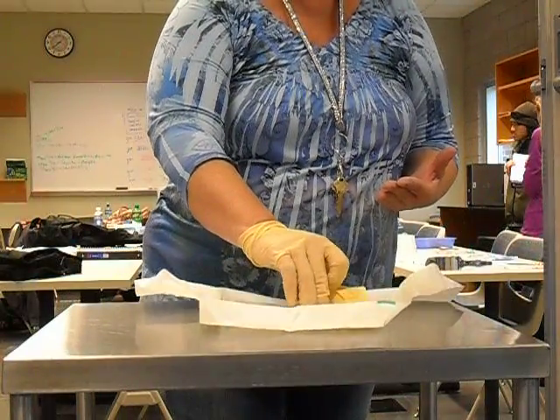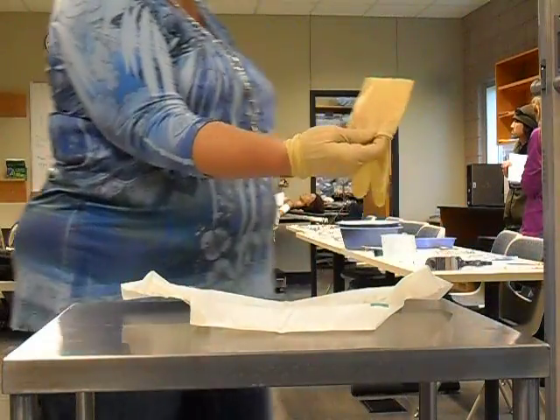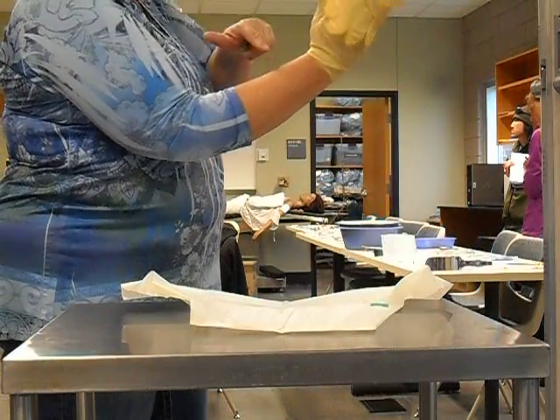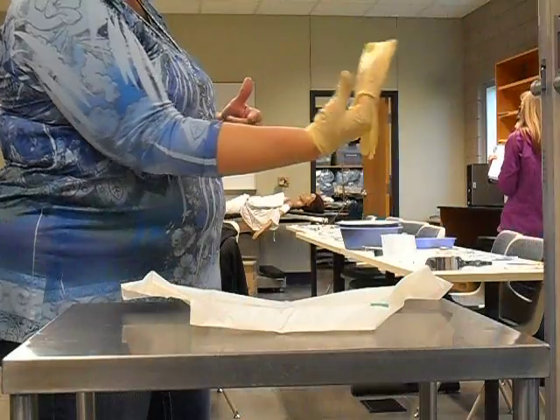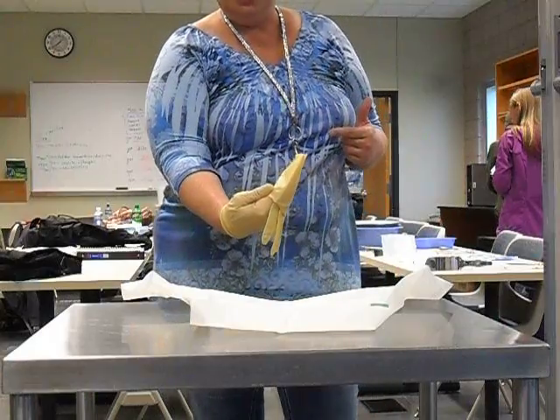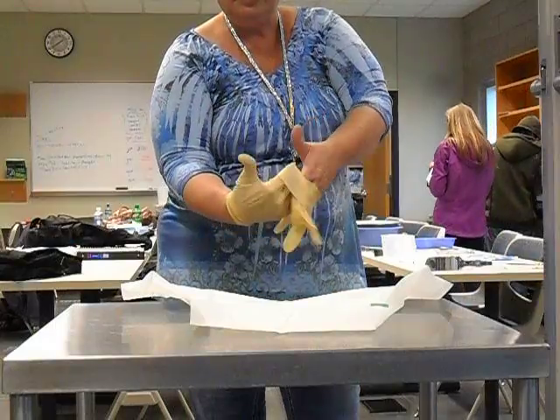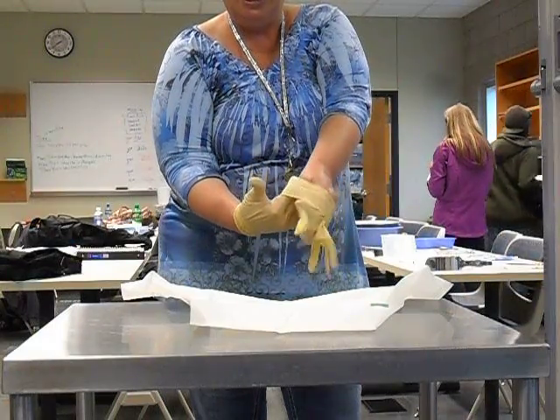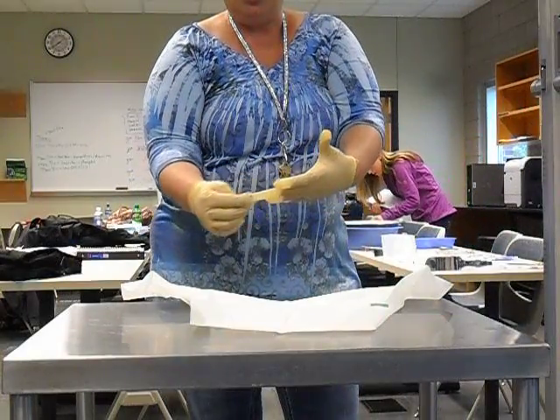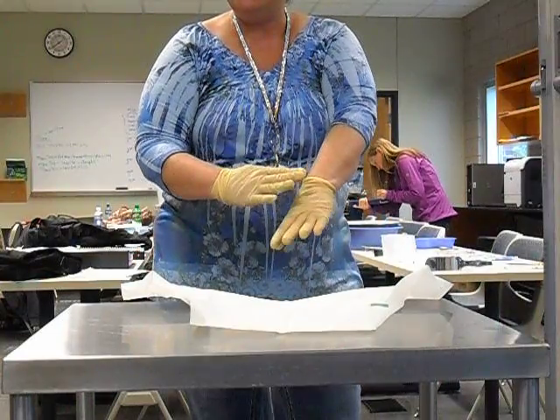Now the second glove, you want to reach inside underneath the cuff onto the sterile fingers. So you're going to grab the glove and put your hand inside the cuff of the glove, being careful not to let these fingers touch your arm. You can use your thumb to pull it down a little bit. Get it away from an unsterile field, and now you want to get your thumb back. Slide your hand in, and you might not line up your fingers quite right, like I didn't. Okay, now what I can do is stretch and get them on. I can't touch back in here now. I can't adjust this. This stays.